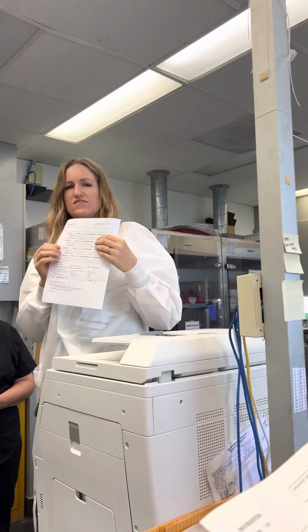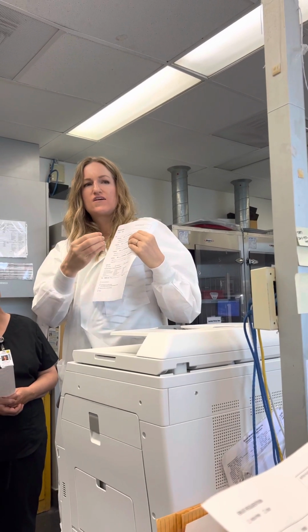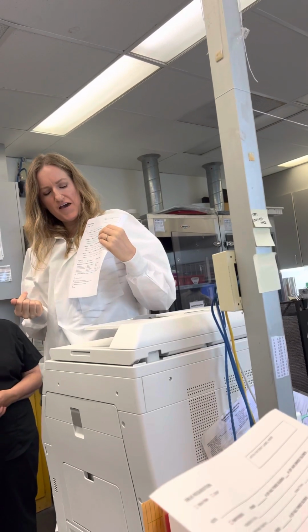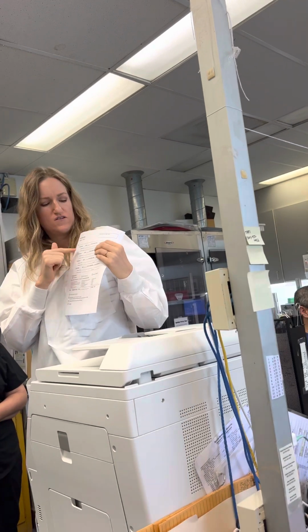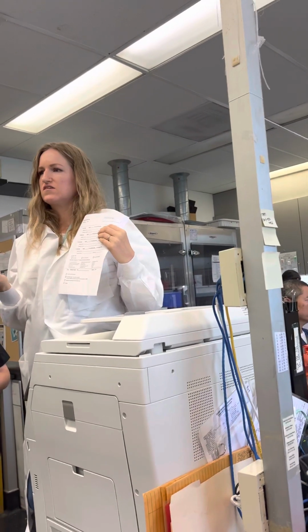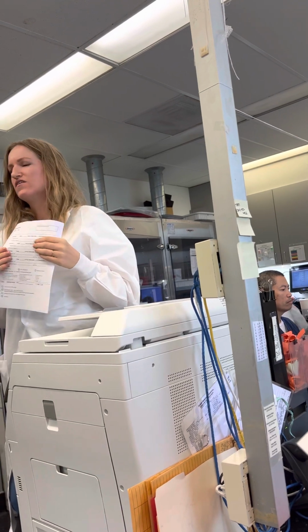So what we would expect is this piece of paper with the site written at the top, 4R, and for every check box, we would expect the container that matches those tests, also each container labeled with the matching site, 4R, and passes should be included, right? So any slides that you're sending, the pass numbers should match whatever's on the paper, and any containers that you're sending, the passes would be on there too. Separate bags too, like 4R has a 4R bag, that'd be awesome. Yeah, that would be great.